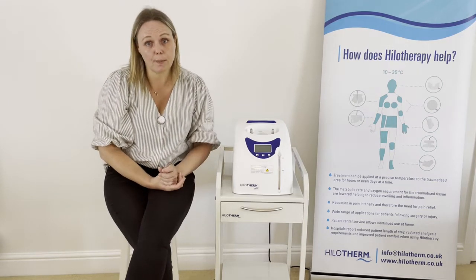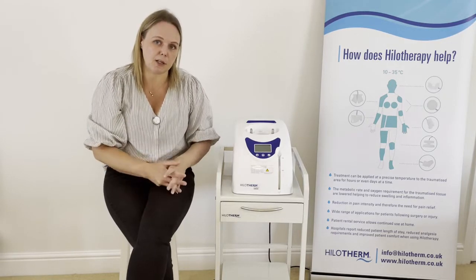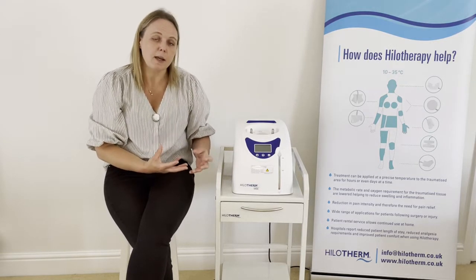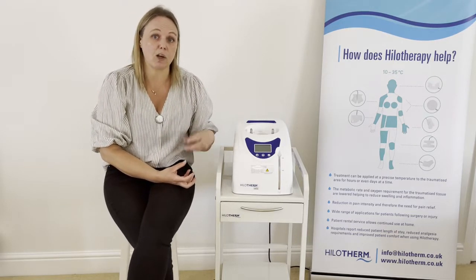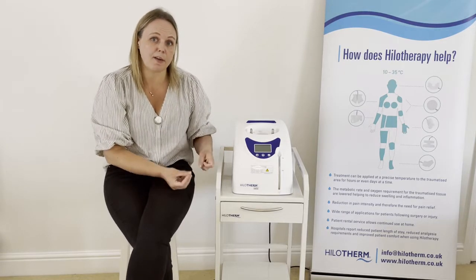It's worth bearing in mind that for orthopaedic surgery in particular there is often thicker bandaging, especially immediately post-op. If that is the case you may want to reduce the temperature down below 15 degrees — so you may want to take it down to say 12 degrees. But you will find that if you go as low as 10 or 11 degrees you may start to get condensation.